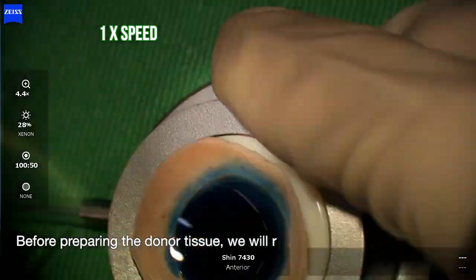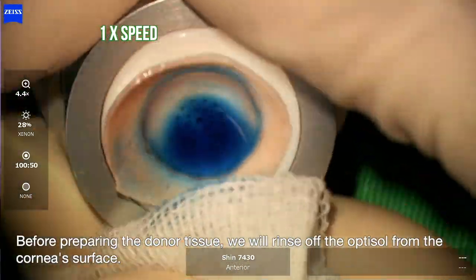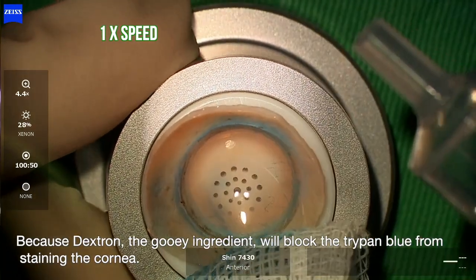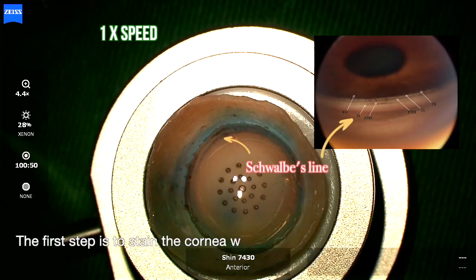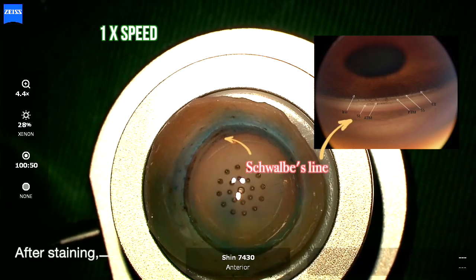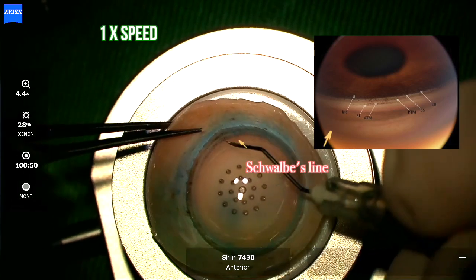Before preparing the donor tissue, we will rinse off the Optisol from the cornea's surface, because dextran, the gooey ingredient, will block the trypan blue from staining the cornea. The first step is to stain the cornea with trypan blue to define the Schwalbe line. After staining, inspect the cornea to obtain more information.